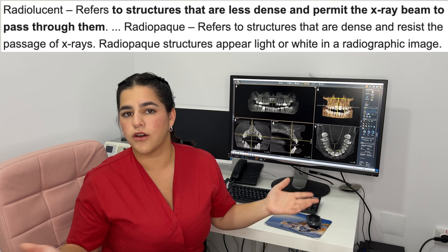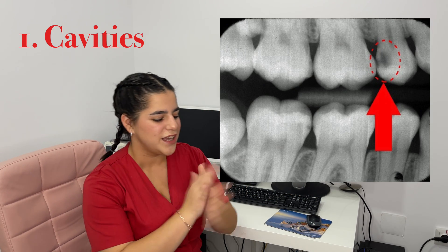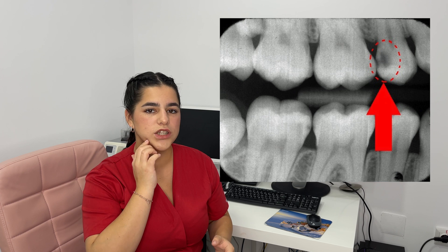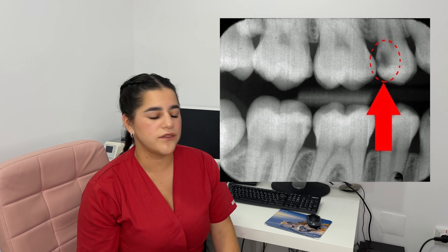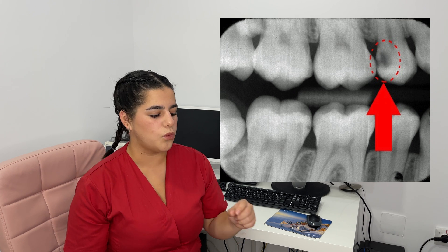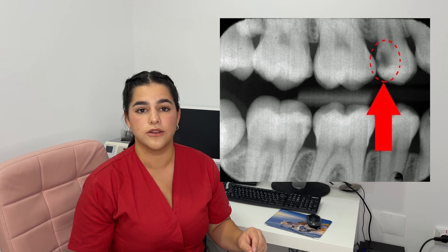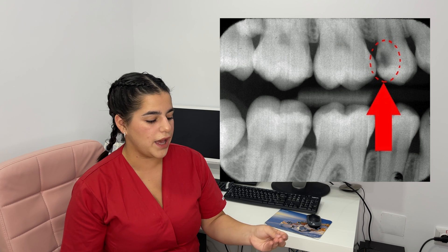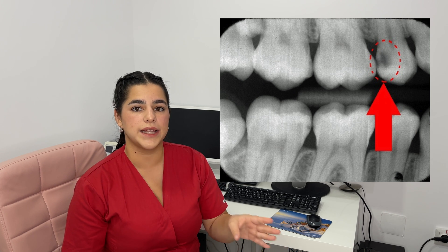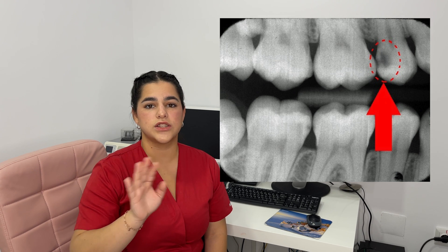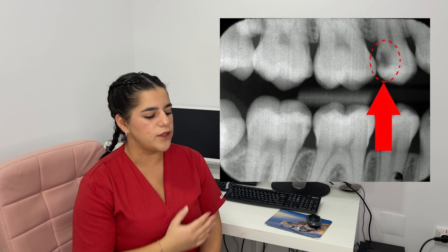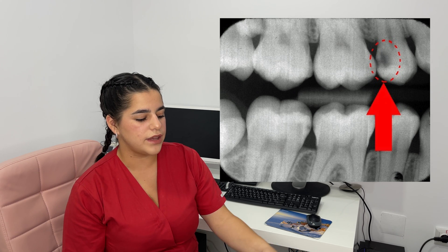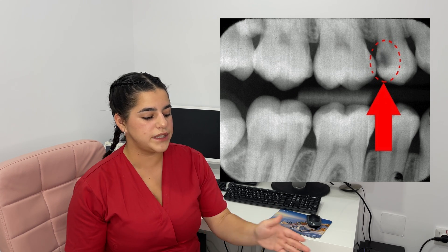First, cavities. Looking at a picture showing upper and lower teeth — the first and fourth quadrant — on the second premolar in the first quadrant, you can see a very deep cavity. It might not look that big, but once we open the tooth, I do think it will require endodontic treatment. The enamel is very white because it's radio-opaque, and inside the enamel and dentin there is radio-translucency — shades of black and gray — that is the carious lesion we can see right there. The nearby healthy tooth looks just fine, whitish with no issues.